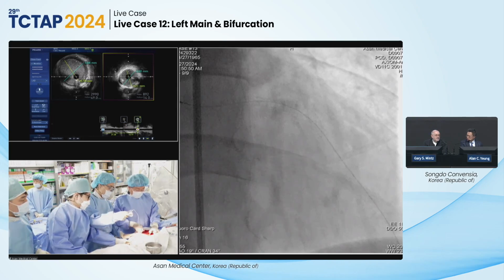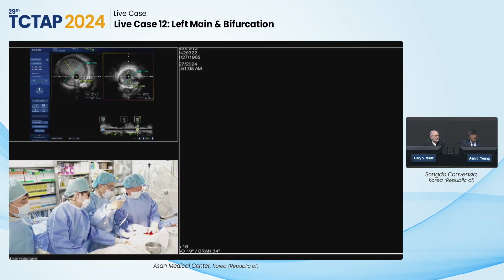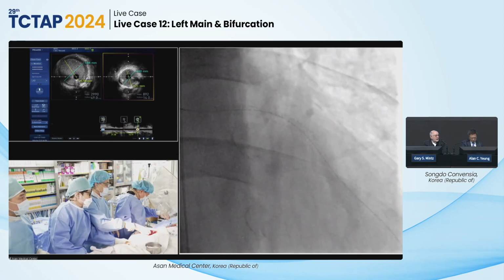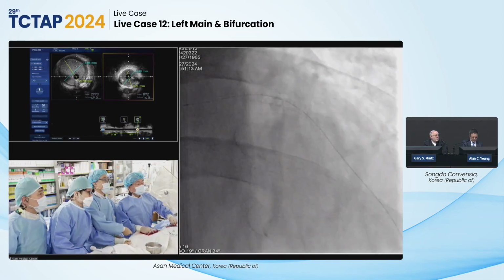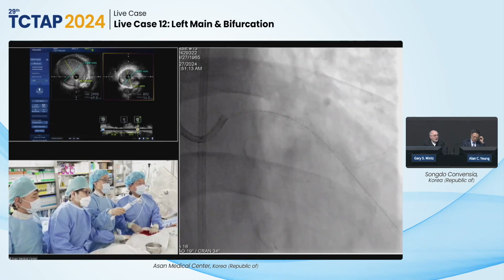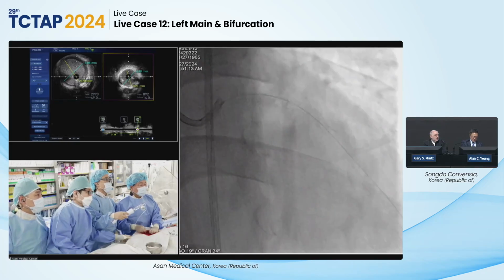For the audience, if you stent into the bridge, you run the risk that the stent will collapse during follow-up, and you'll have a very difficult to treat restenosis, totally based on an unnecessary mechanical mistake, let's call it.